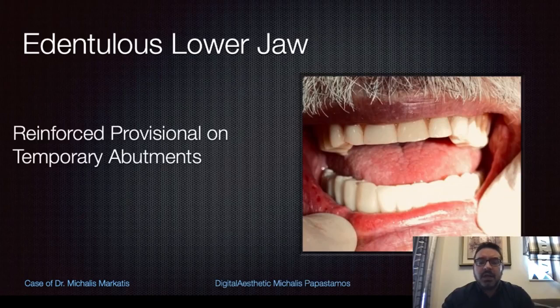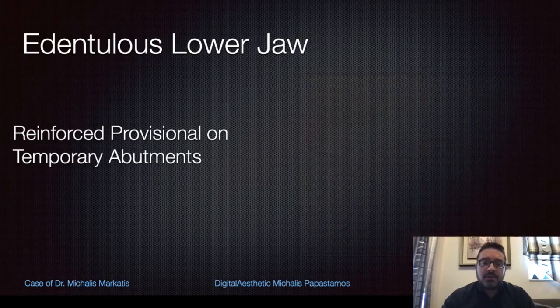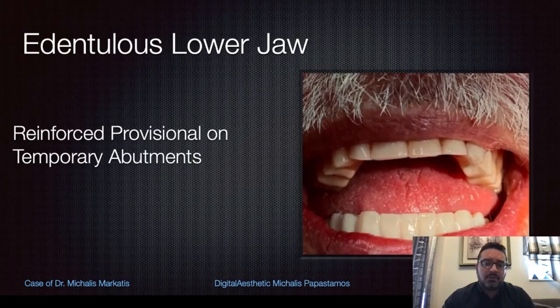As you can see, it is a full CAD-CAM prosthesis. The engagement took place in the mouth of the patient the same day that we placed the implants. You can see that there is a very good result with the provisional, with the color the doctor chose, and the digital aesthetic that Michalis Papastamos' lab produced for him.